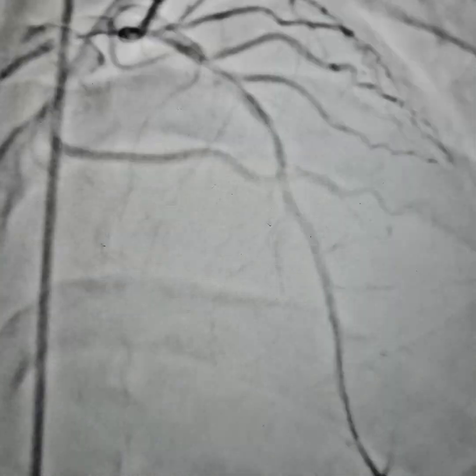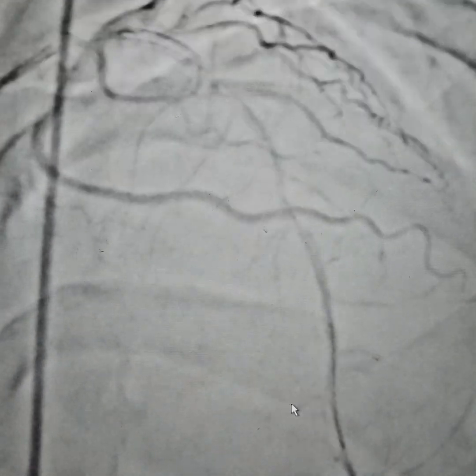We are predilatating with a 2 by 10 mm or 2 by 12 mm semi-compliant balloon at about 8 to 10 atmospheric pressure. After the predilatation, the artery has opened up and we can see that the flow is maintained now.